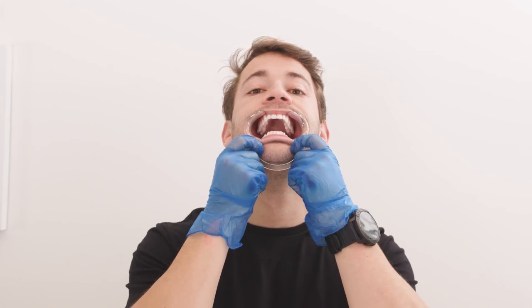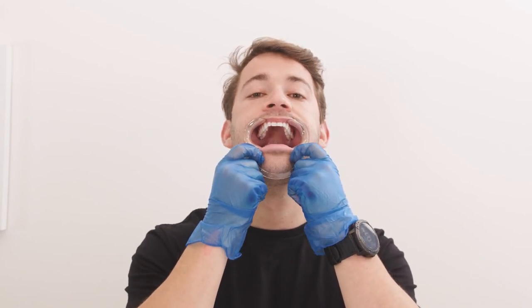Next is your lower teeth. Similarly, we need to see the surfaces of your bottom teeth all the way to the back. Make sure your tongue is not covering your bottom teeth.